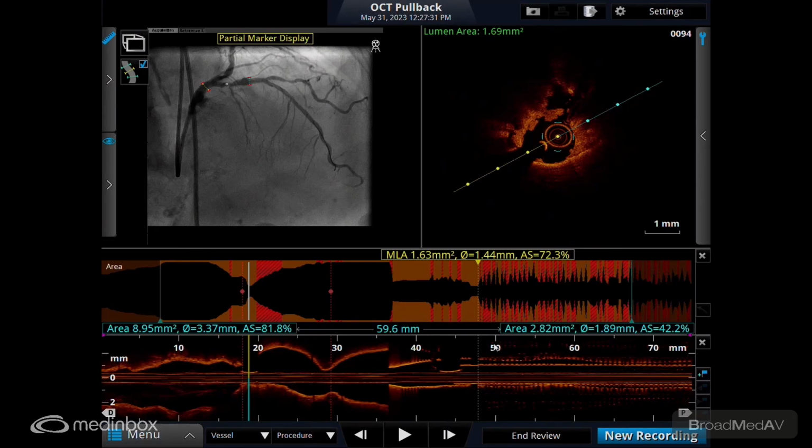Trying to get your, gotta write this wire one more time. Sorry, Sheila, I'm going to put this over here. Thanks. You don't need this anymore. Yeah, I'm going to take that out too. Just when they're ready, we'll wipe it and put it in. Okay. Yeah, so we'll do this part here. I'm going to pull our universal out.